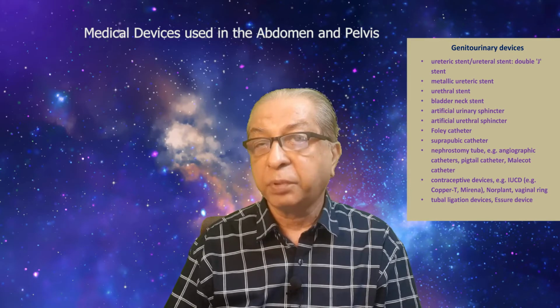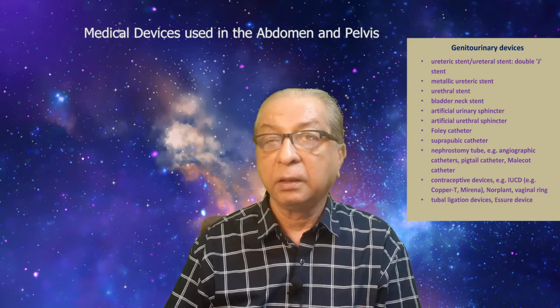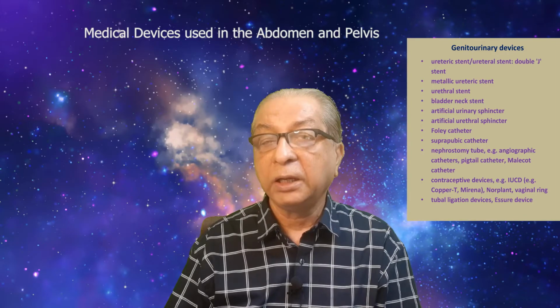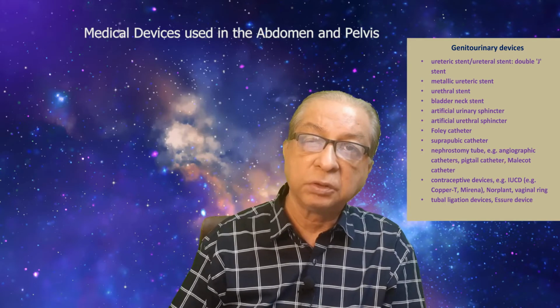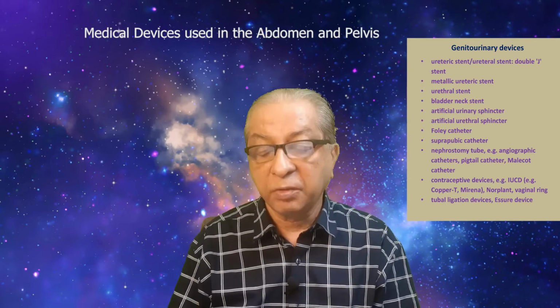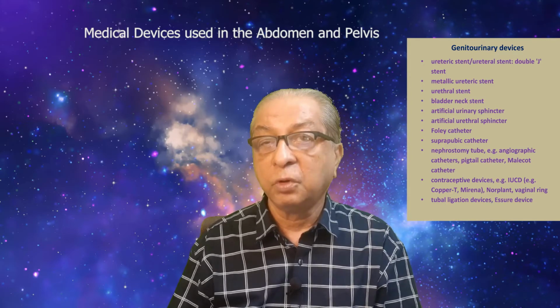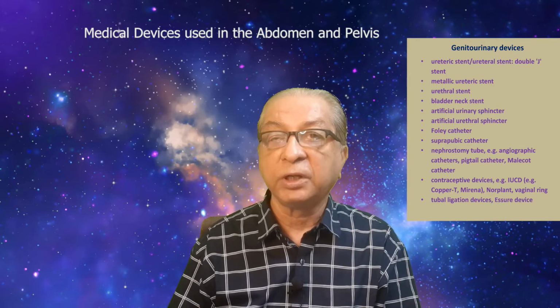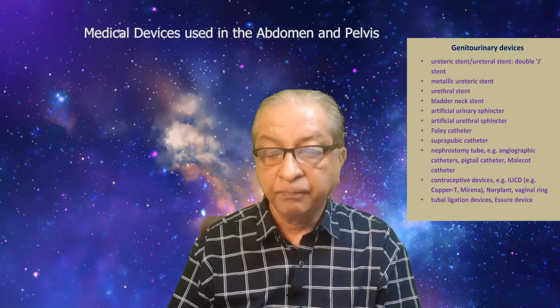Then some people will have leaking of urine. There the sphincters are fixed as devices. Then you know and have seen Foley catheters for taking out urine.